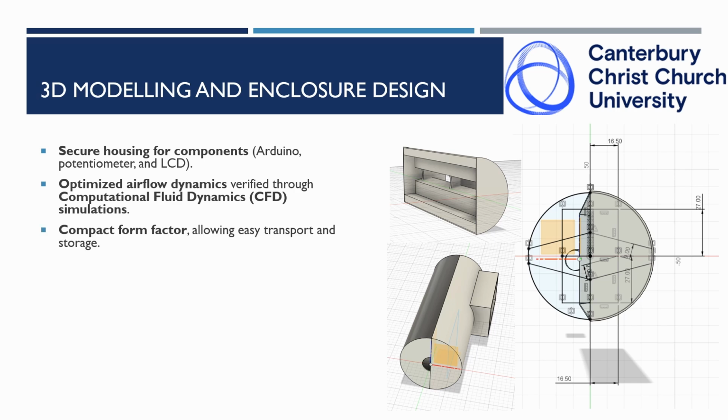It has a compact form factor, permitting easy transport and storage, and single-use cardboard mouthpieces for hygiene and cost effectiveness. The enclosure was rigorously tested with both Arduino Nano and standard Arduino boards to validate design flexibility and compatibility.